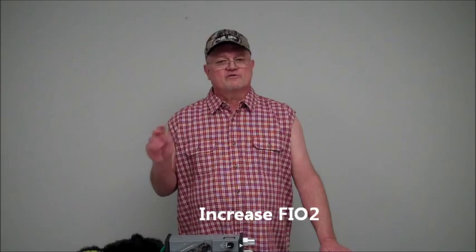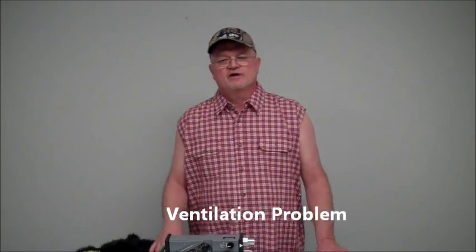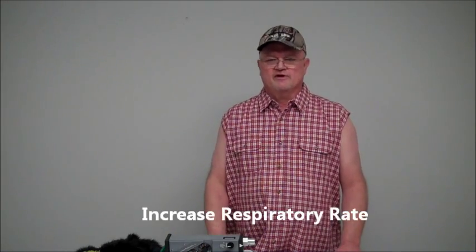To review, if we're having an oxygenation problem, we can increase the FiO2 or increase the PEEP. If we're having a ventilation problem, we can increase the tidal volume or increase the respiratory rate.